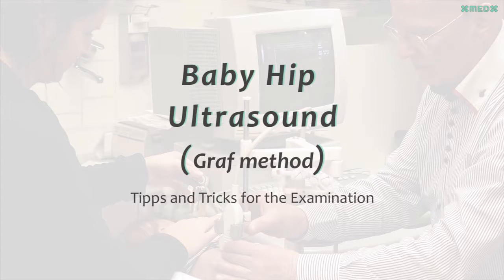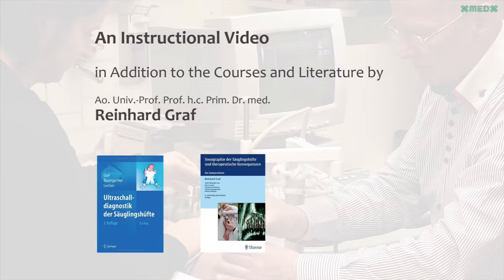Baby hip ultrasound Graf method: tips and tricks for the examination. This is an instructional video in addition to courses and literature. I would like to share a few tips and tricks on how to examine the baby without causing too much stress for the baby, the mother, and not to forget, the person examining the baby.